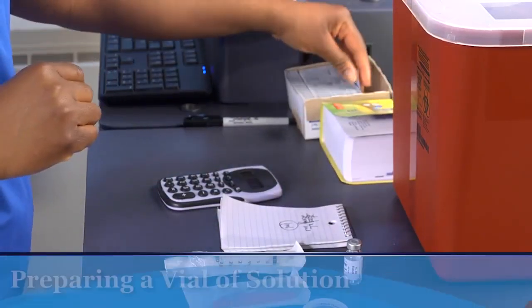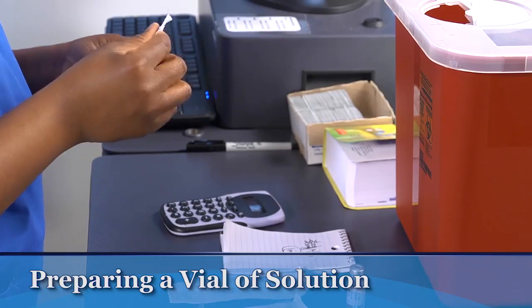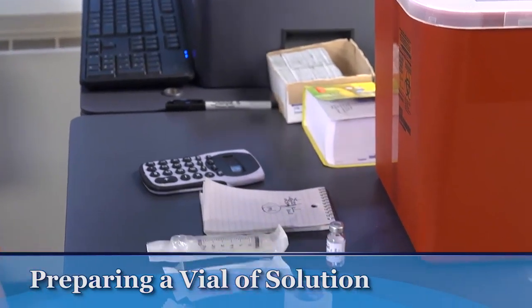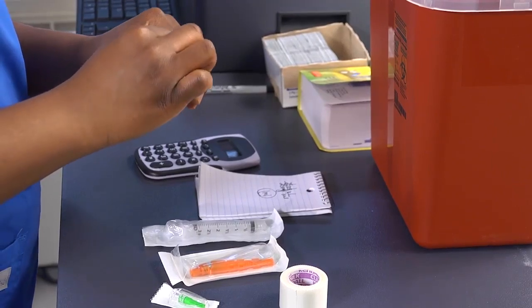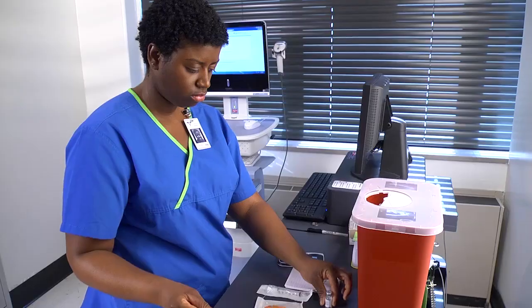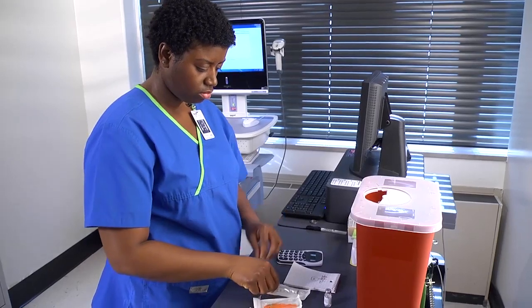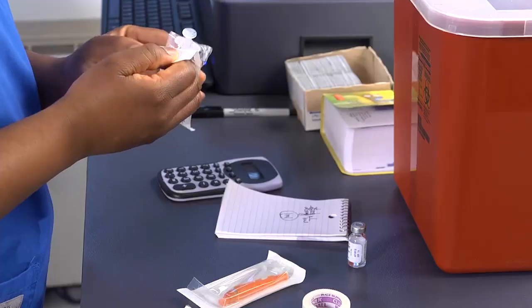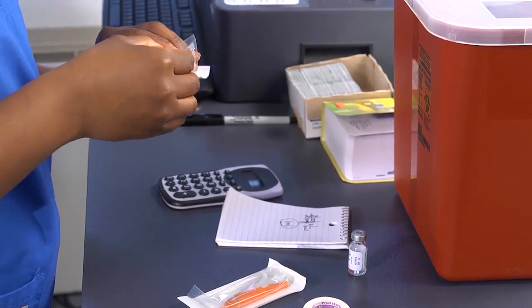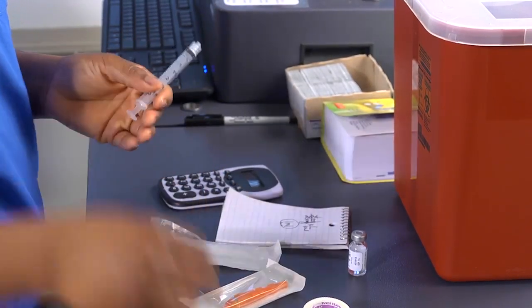If the vial has not been opened, remove the cap to expose the rubber seal. Firmly wipe the surface of the rubber seal with an alcohol swab and let it dry. Select a syringe and attach a needle or needleless access device. If the syringe is capped, remove the cap first.